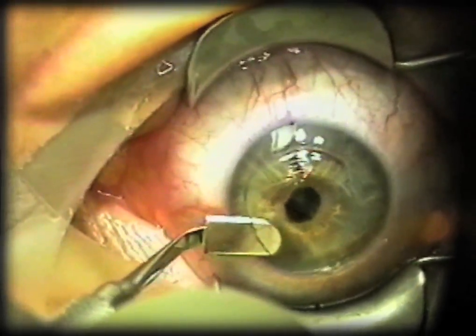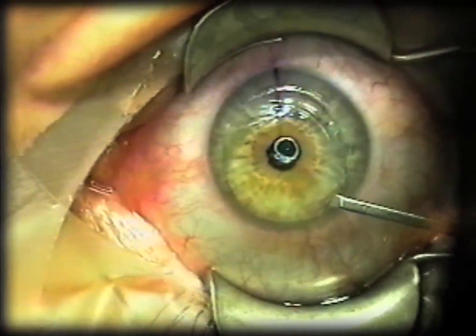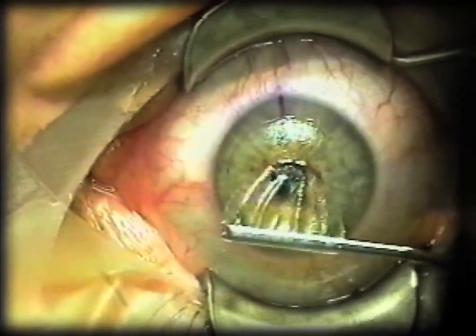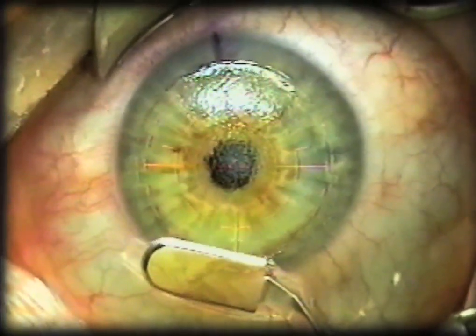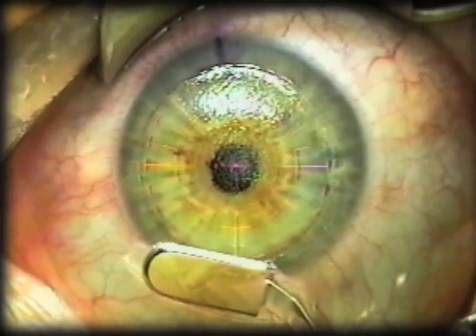Now the other end of the spatula — the thin end — is used to free up and flip over the flap. Another use for the broad end of the spatula is to provide hinge protection in the case of a wide ablation that could potentially put laser pulses onto the hinge.